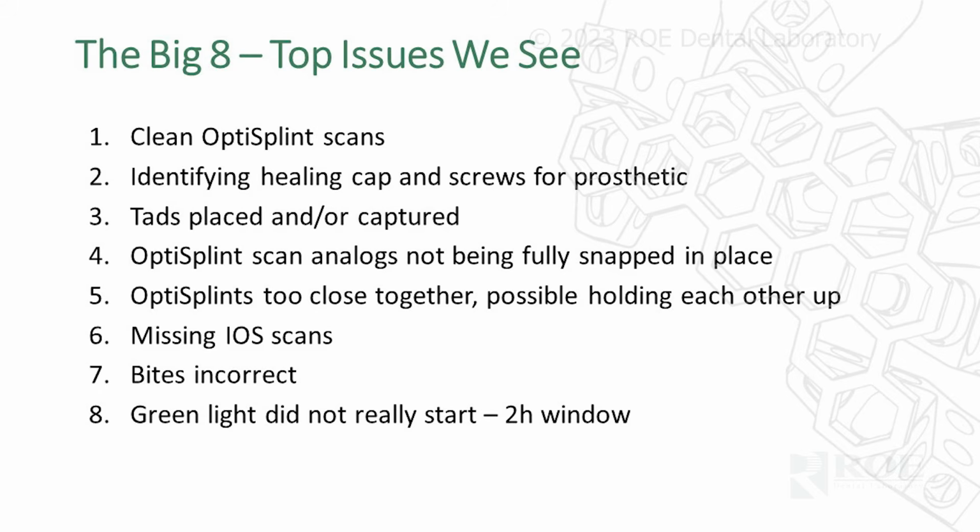Be sure that you have all of your scans. We had to basically develop a customer service team to call for missing files and to communicate, because we know it's time-sensitive, right? I mean, we only have so much time before you need this file back, but we're missing a bunch of records. And then just be careful with bites, right? If the bite comes in wrong, you're going to be adjusting, right? So we want to be very, very careful with bite registrations.